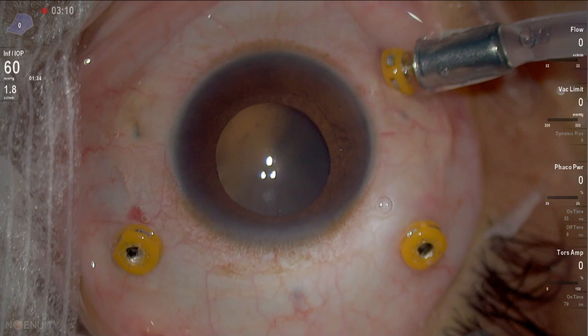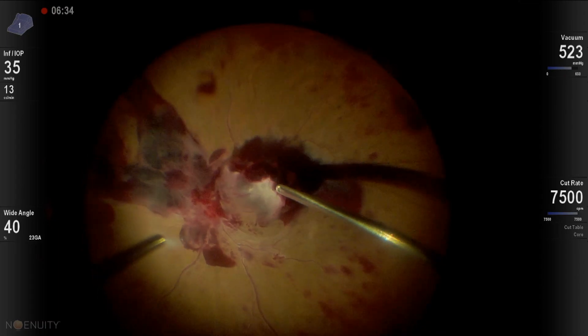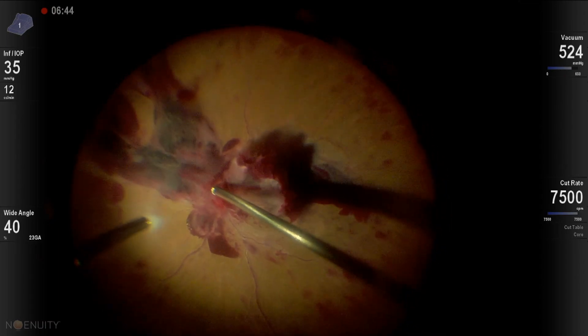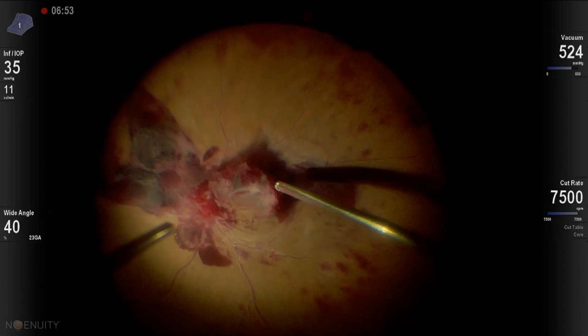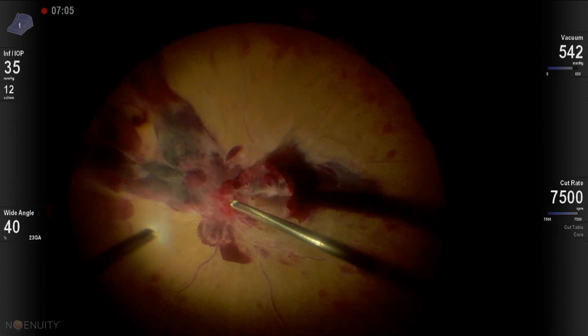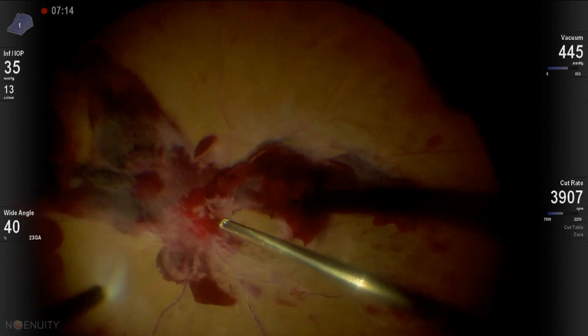Hi, there's a case of tractional diabetic detachment that we operated using 23 gauge vitrectomy. This is actually the best seeing eye of the patient. The other eye is in a terrible state and we're operating later. Starting here with 23 gauge, this is after anti-VEGF and you have this organized vitreous hemorrhage with traction emanating from the disc.